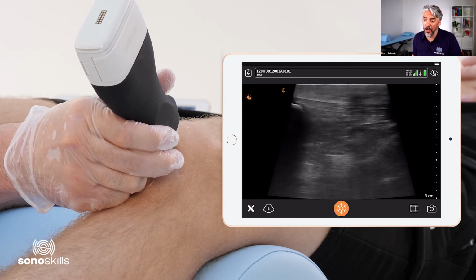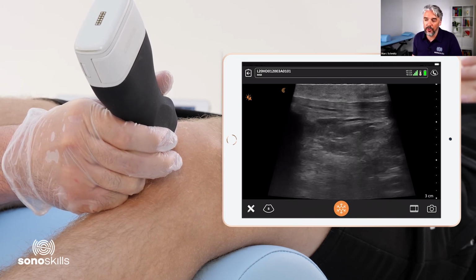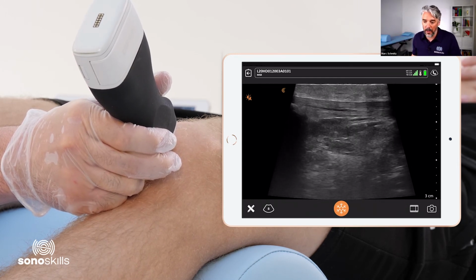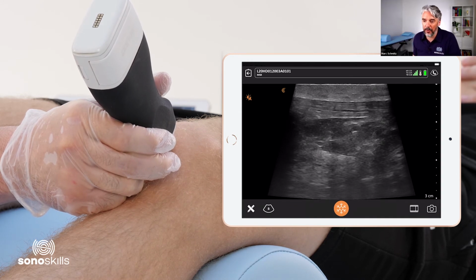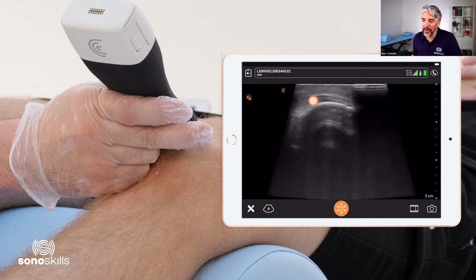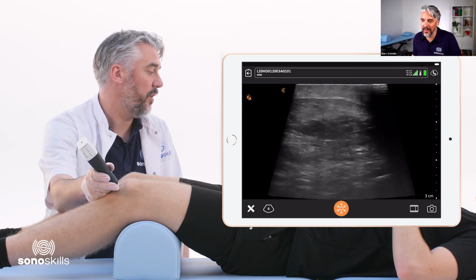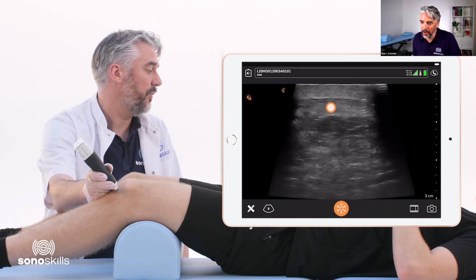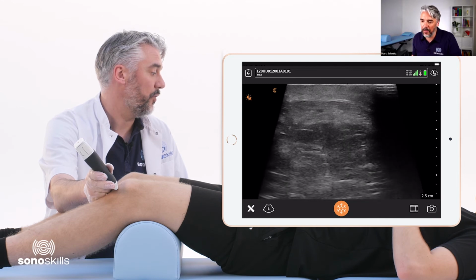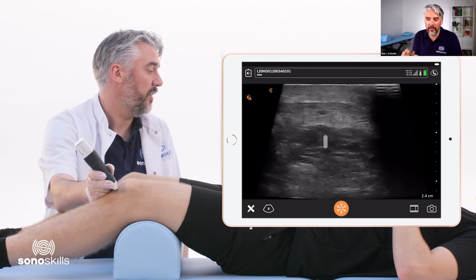Moving back up to proximal, at one point you can also rotate the transducer 90 degrees and look at it from a transverse perspective, like this, for example. So placing the transducer on top of the patella, we can see the sliding off the patella, we can see the cross-section of the tendon, and within the tendon we can see again the pathology he had, this little partial tear. You can see that the tear is not very wide, but it's very long.